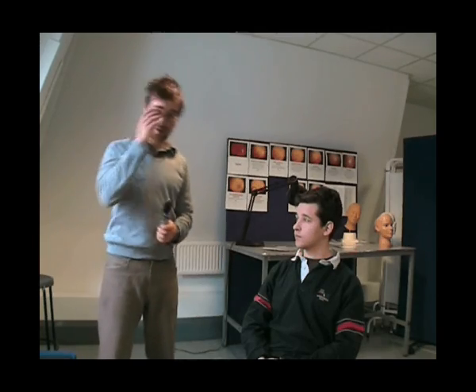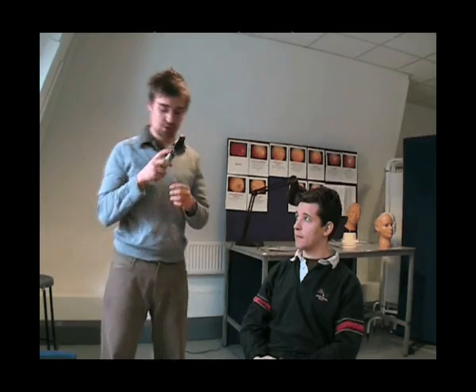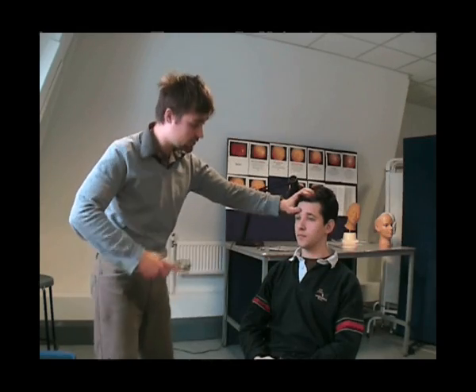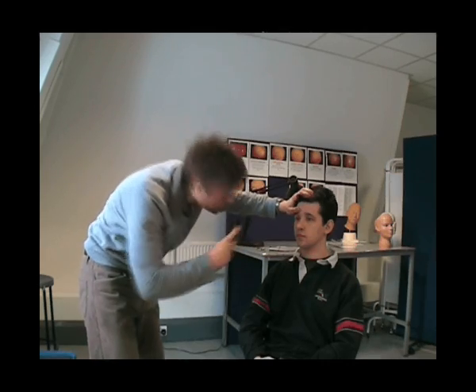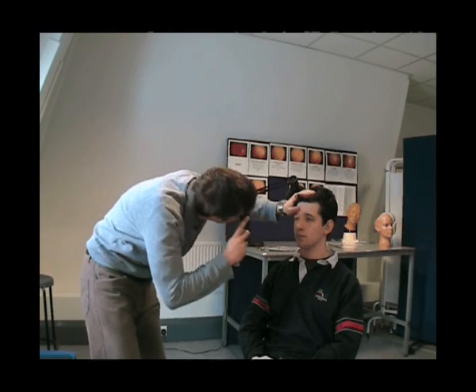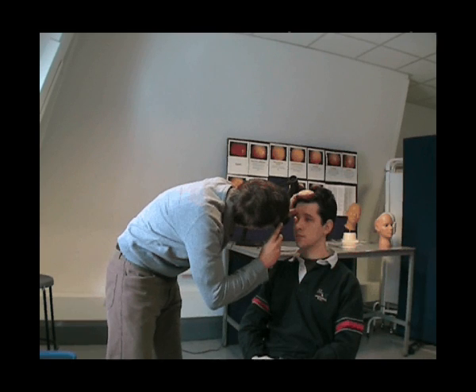Now we're ready to use the ophthalmoscope. Make sure it is on, and take off your glasses if you have them on. Make sure the ophthalmoscope is set to plus 10. Put your hand on the patient's head, and from 30 centimetres away, look for the red eye reflex. This is like what you get when you take a picture with a camera and it flashes. I can see the red eye reflex, and that's fine in this eye. Having seen the red eye reflex, I move in, focusing and dialing down the numbers as I get closer and closer to the eye.